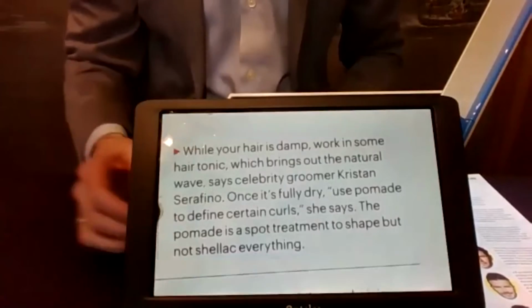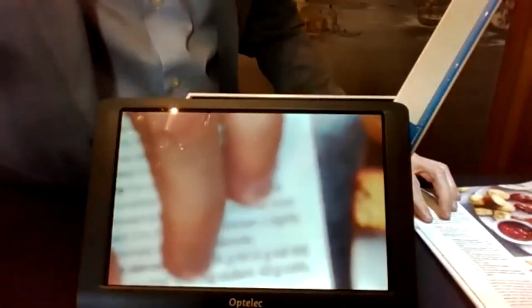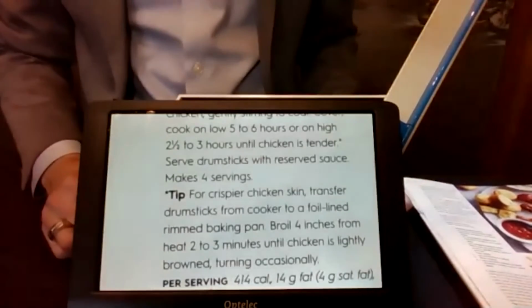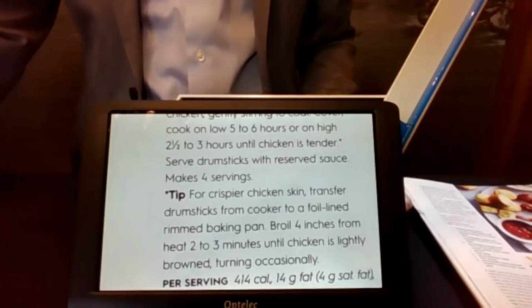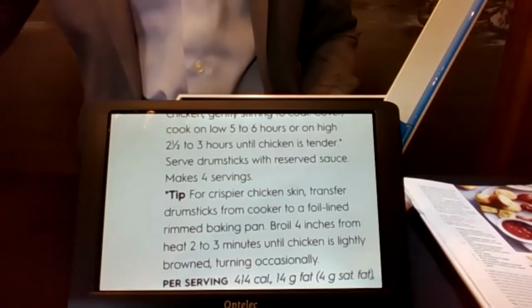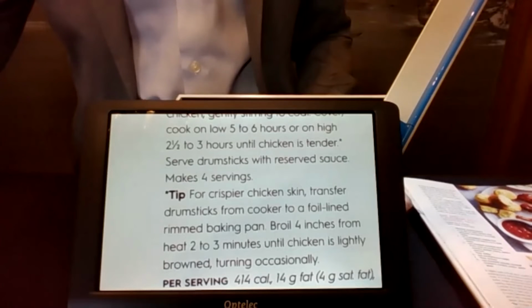That's another thing that's really overlooked. If you can imagine you're a senior writing a greeting card, and you get out this device that has served you well up until this point, and you want to use this writing mode, you could see how very easily it might trip the user into thinking, why can't I use this to write? Because I'm losing focus. So removing those barriers and saying, listen, we've got a mode in here.